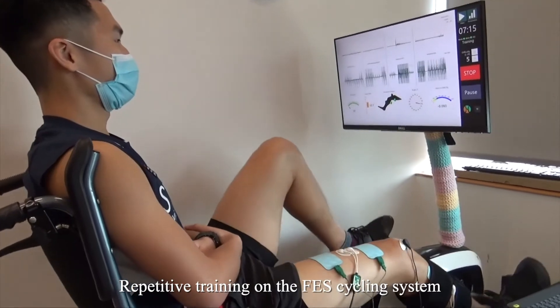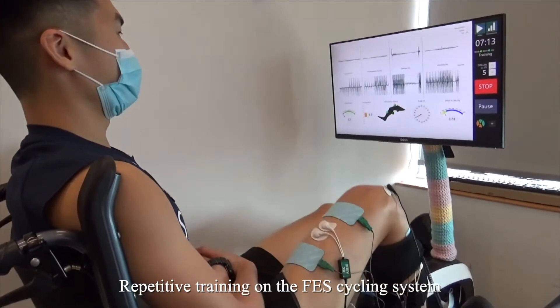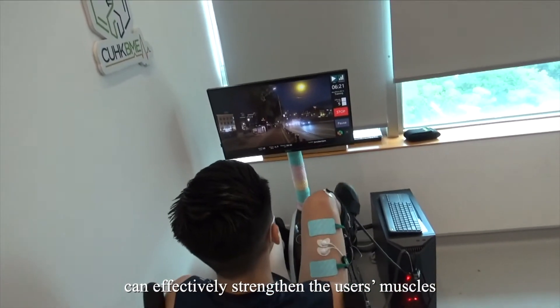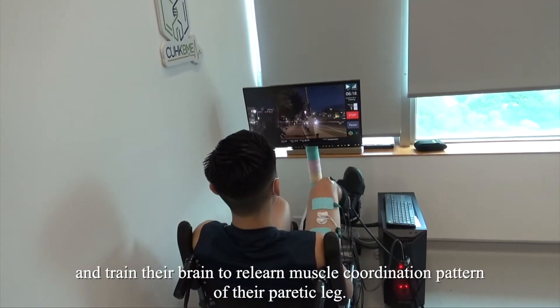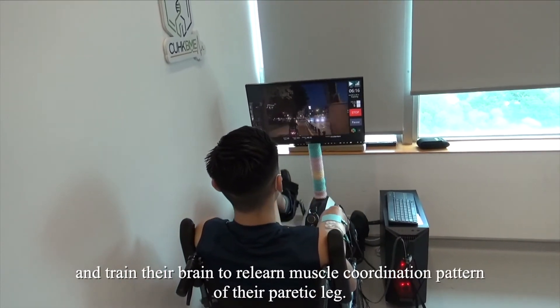Repetitive training on the FES cycling system can effectively strengthen the user's muscles and train their brain to relearn the muscle coordination pattern of their paretic leg.